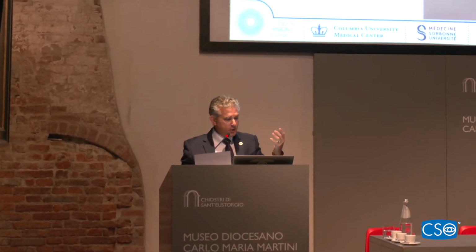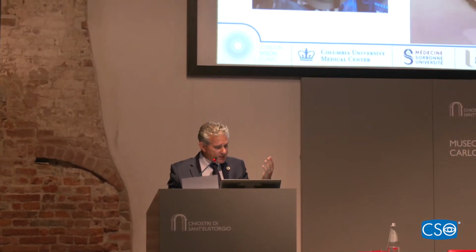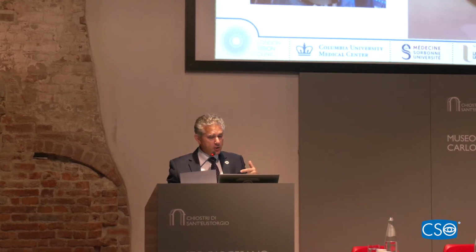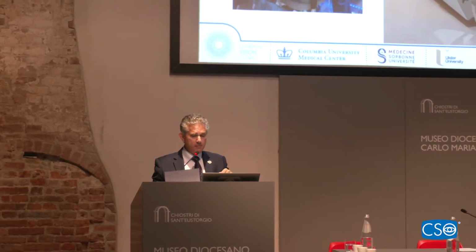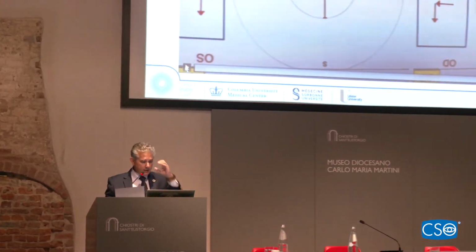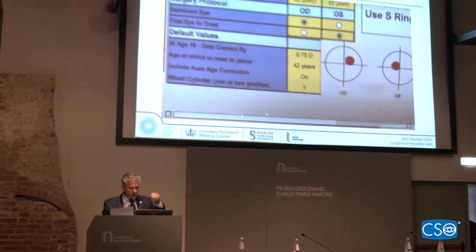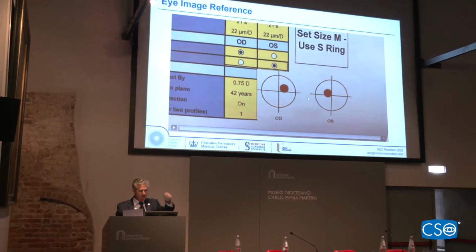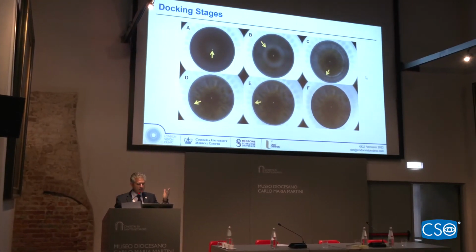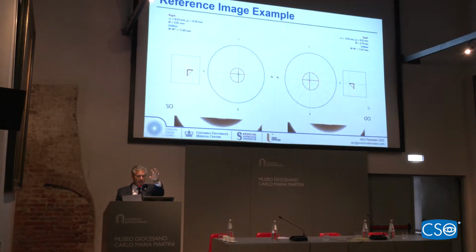And I'm just showing you here my friends in Peru who are following the exact standard operating procedure. And I asked Francesco if he would be able to program this, and he did. So when I do suction, and then I look at this, and then I look at the Hirschberg reflex that I had pre-op, and obviously I have my docking stages of smile, and I have this image in front of me, and I can compare them.